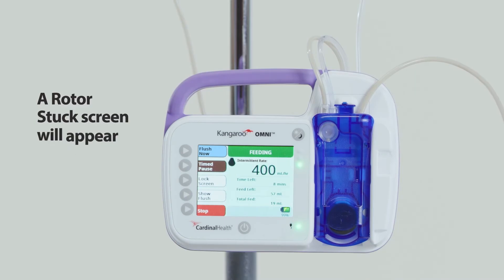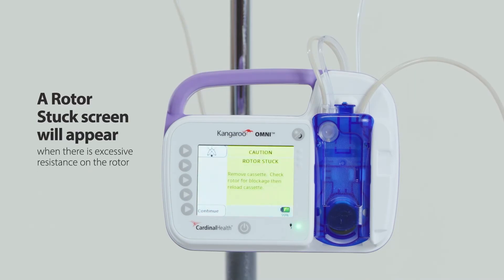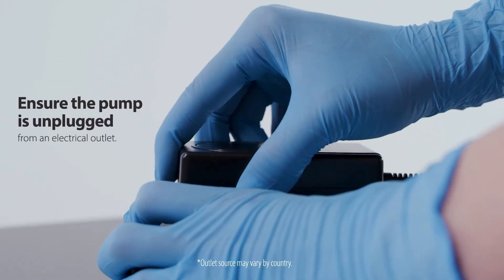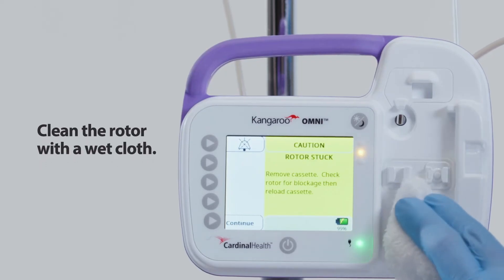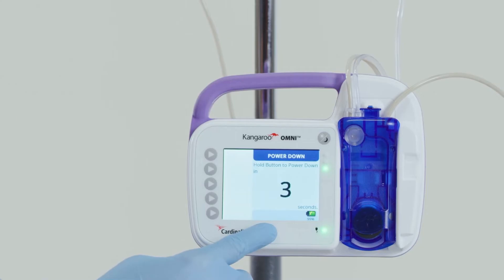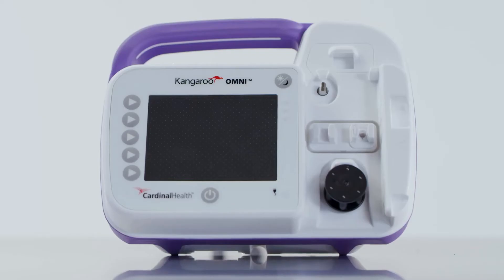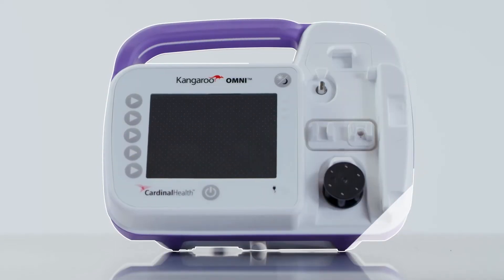Rotor stuck alarm: a rotor stuck screen will appear when the Kangaroo Omni enteral feeding pump detects excessive resistance on the rotor, typically caused by enteral fluids or contaminant buildup. To resolve the alarm, ensure the pump is unplugged from an electrical outlet and clean the rotor with a wet cloth. If the alarm continues, press power off and use a different Kangaroo Omni enteral feeding pump.